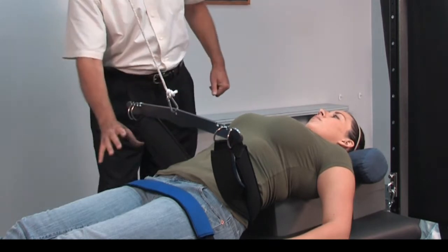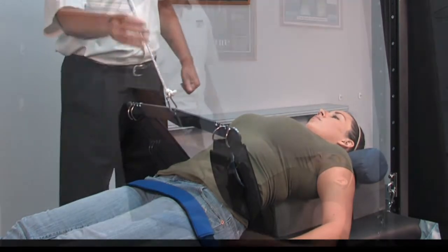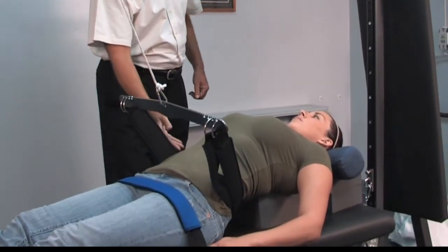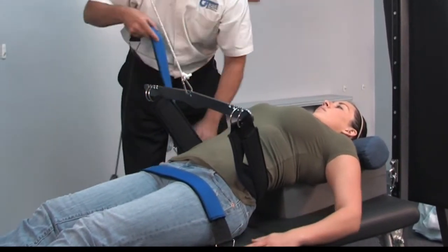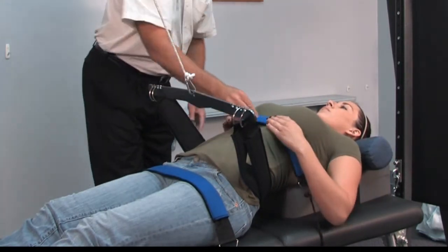We've got it set so that as we pull we can get the anterior tilt to the pelvis. If there's a lot of loss of curvature in the lumbar spine and you want to try to concentrate that traction more, you can place a second strap across the lower rib cage, right below the chest.